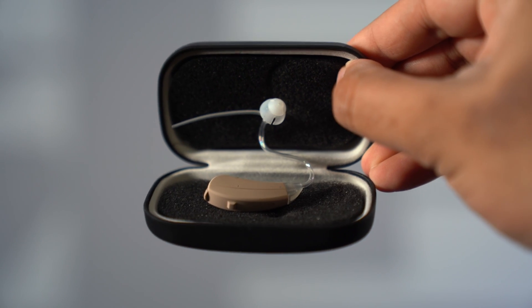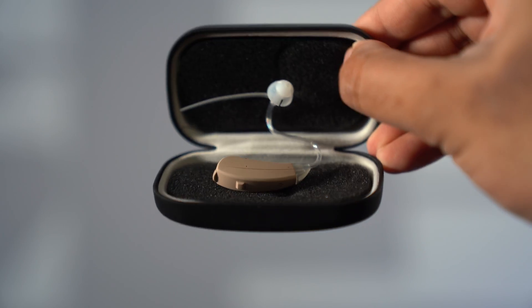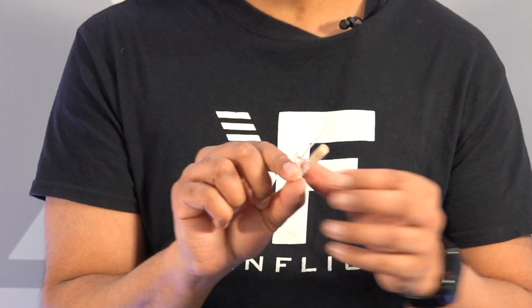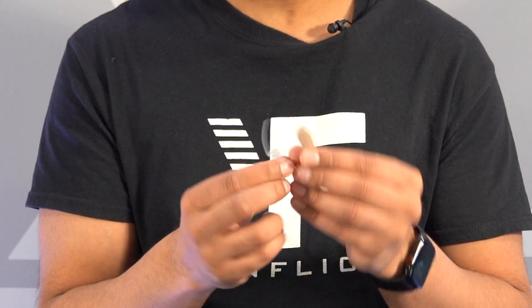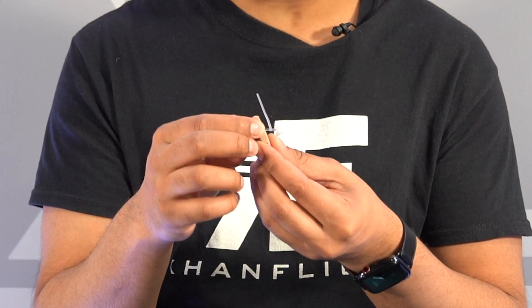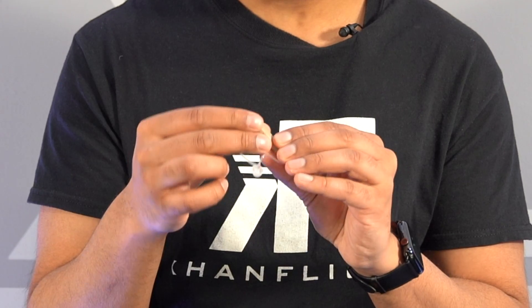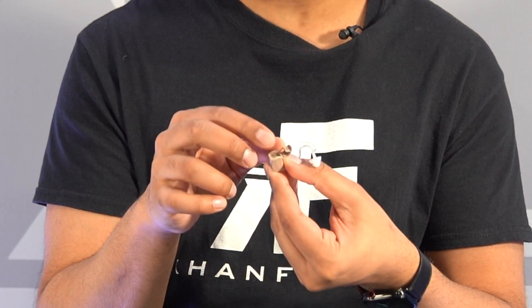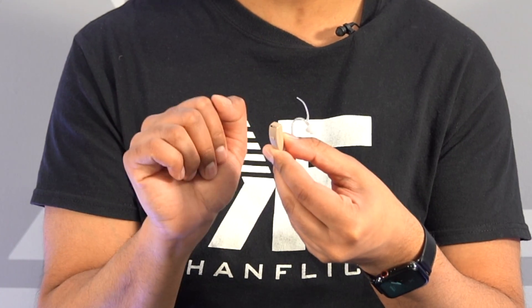Opening it up — these are a lot smaller than I was imagining. Very nice, very conveniently sized. You have your switch right here to turn it on, and then you have your battery port which pops off just like this, and you insert your battery right there. This locks into place just like that.